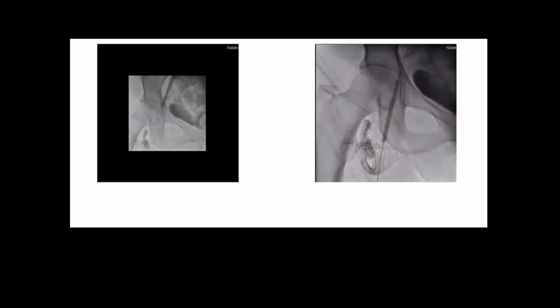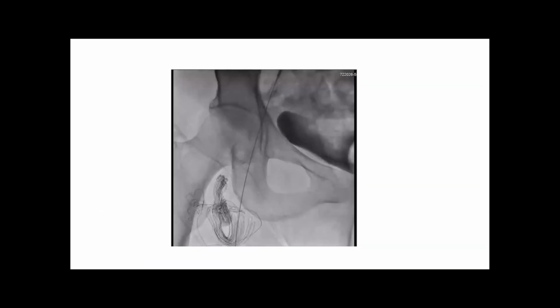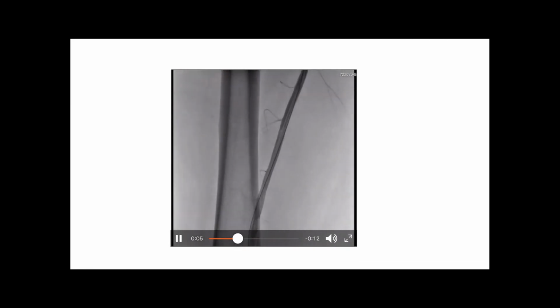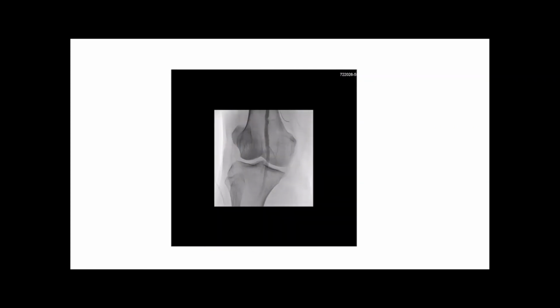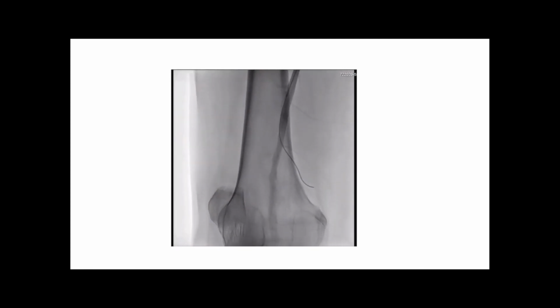So what we did is a balloon dilatation with a 5 millimeter balloon here, prolonged dilatations, multiple 2-3 minute dilatations, and after that we had this flow. So definitely there was no local lesion, just thrombus, and distal flush was good. We thought about putting a stent, but it's a high flow system. You put the patient on heparin. Had the flow not been this good, we could have thought of stenting, but since the flow was good, we left the patient on heparin, and this patient did well.